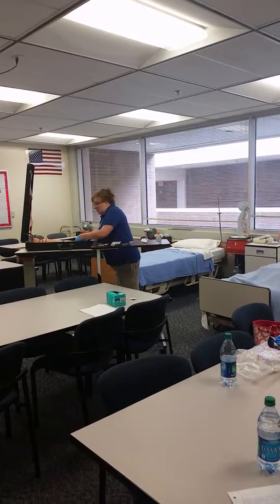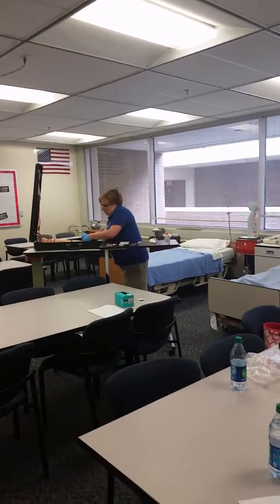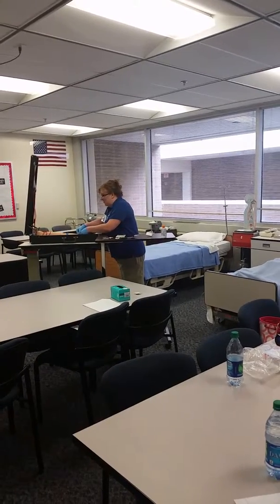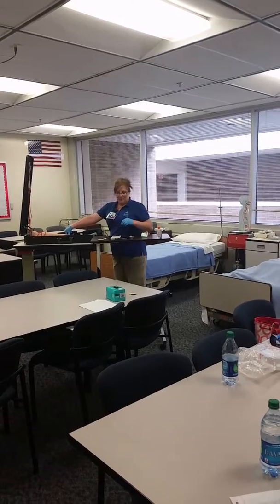Okay, I'm going to look for blood flashback. When I see it, I'm going to advance and lower the catheter, pulling the needle out, pop the tourniquet. I'm going to apply positive pressure.